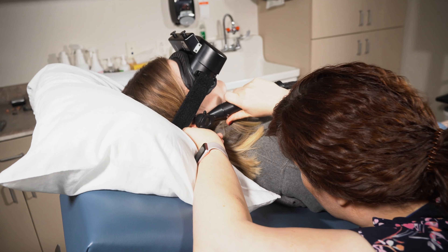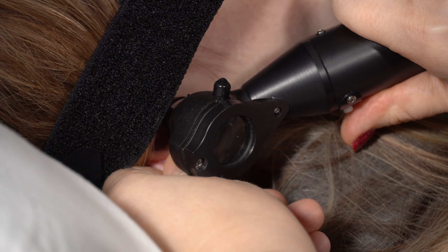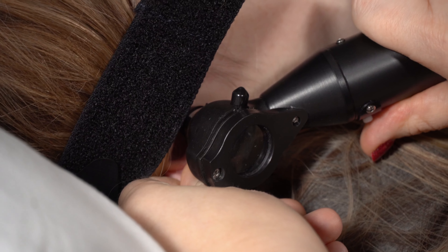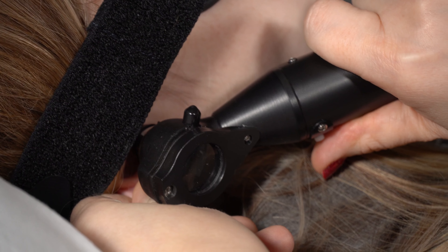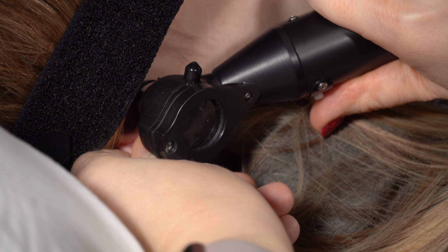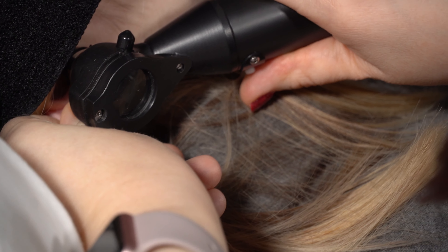I'm looking at the eardrum to make sure the air is going where I need it. About 20 seconds in she would start to feel like she's floating or spinning. If people don't get dizzy here, that's actually a bad sign because that means their ear is not working properly. But if they get dizzy, that's what we want, and we compare one ear to the other.